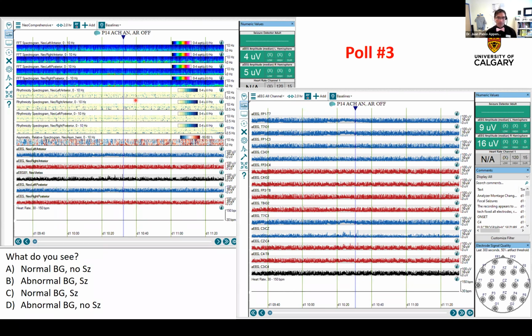And we are seeing these traces, and I can tell you this is a very nice way of looking at several EEG waveforms at the same time as well. You can see also by quadrants and midline, as well as the FFT spectrogram, the rhythmicity, and the asymmetry, in which newborns, most of them have focal seizures, and I found it sometimes helpful to have it. So I'm just talking so that you cannot think and you answer whatever.